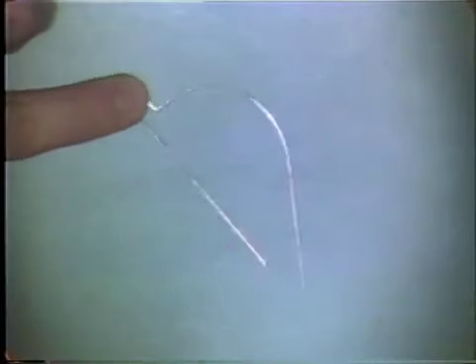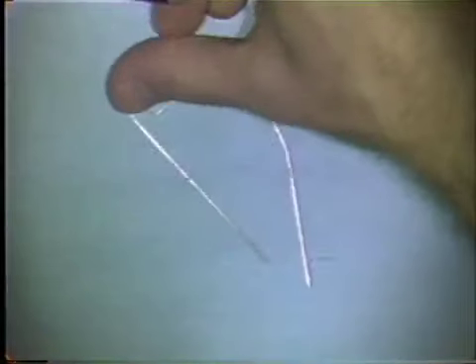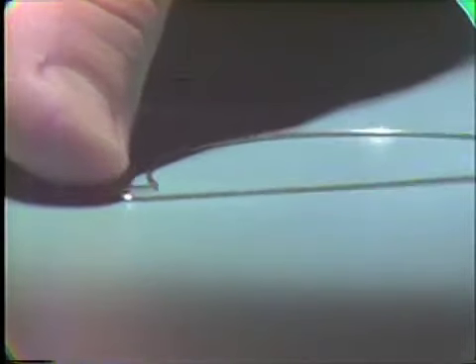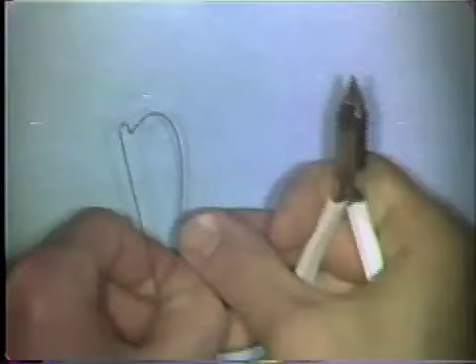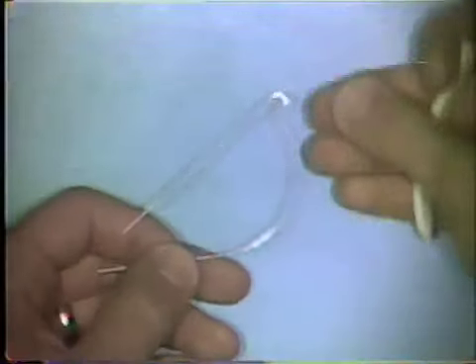This is done by pushing down on the loop that you've just formed and holding the loop on the table surface. If it rocks, you know that some adjustment has to be made. You pick the wire up and look at it from the side view and check the plane in space to see which section of the wire is off. In this case, the entire curvature portion has to be bent upward so that the loop will adapt to the table.